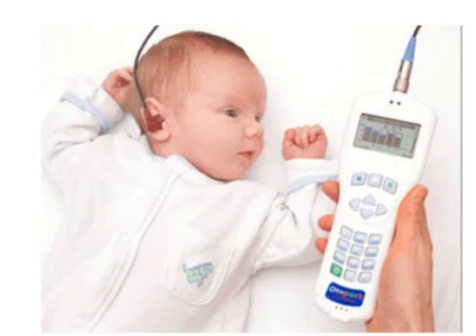Continuing education activity. Otoacoustic emissions testing offers another modality of evaluation of the auditory system beyond conventional audiometry. It may be performed for patients with suspected hearing loss who cannot tolerate or complete conventional hearing tests. The testing does not require recording a patient's subjective response to sound. There are several different ways to measure otoacoustic emissions, each with advantages and disadvantages.